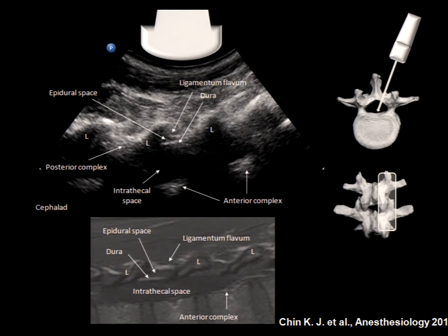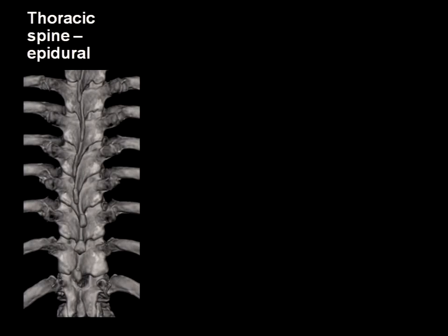When I measure this distance, I know I can go in as deep as this, and then I have to be more careful and I can feel the loss of resistance, because I believe when we have the window where we can go in with the loss of resistance, we have a good technique to find the epidural space, or when we do a spinal with the fluid coming back, the cerebrospinal fluid, another good tool that we are sure we are there.